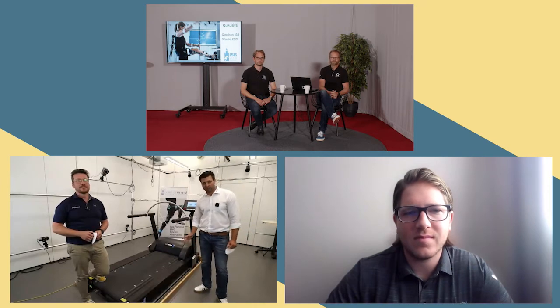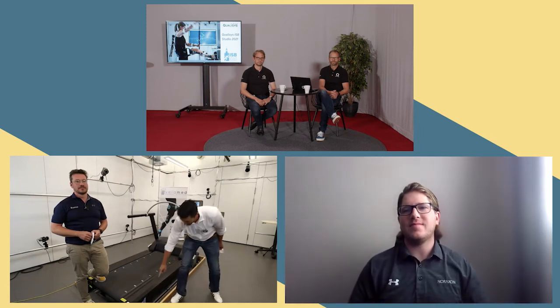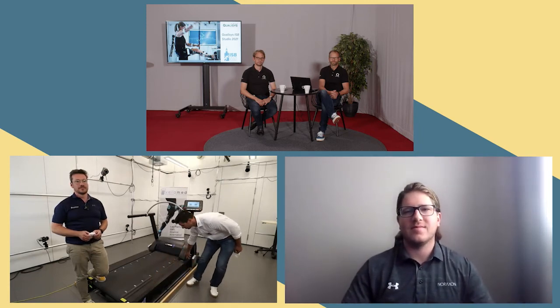Yes, thank you, Patrick. My microphone is activated. The Gateway has built-in load cells, 4 of them, one in each corner of the treadmill, so creating like a big force plate. It's what we say, a single belt treadmill in contrast to a split belt. A split belt could be side by side or like a tandem fore-aft orientation, so two belts next to each other in front or side by side.